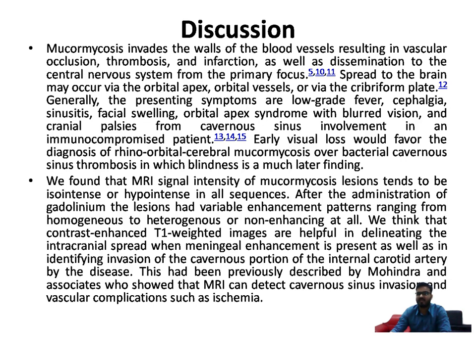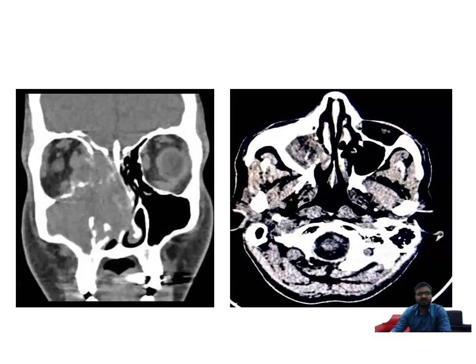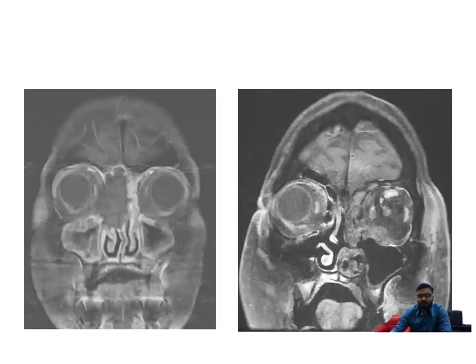This has been previously described by Mohindra and associates, who showed that MRI can detect cavernous sinus invasion and vascular complications such as ischemia. This coronal CT image at the level of the maxillary sinus and nasal cavity shows a large isodense mass lesion in the right maxillary sinus extending into the nasal cavity and ipsilateral orbit with bone destruction. A post-contrast coronal image shows mucosal thickening of the right maxillary sinus with a large isodense non-enhancing mass lesion involving the ethmoidal air cells.